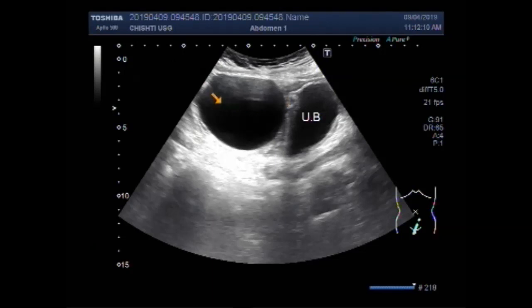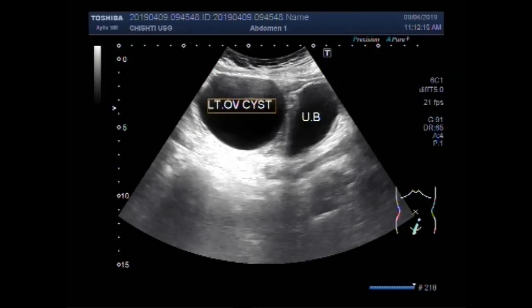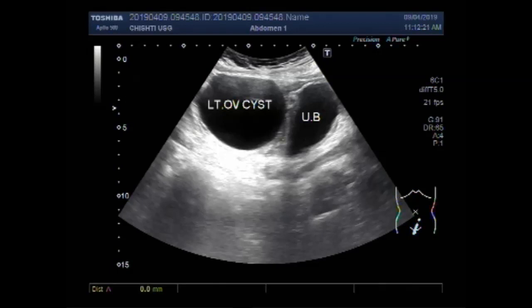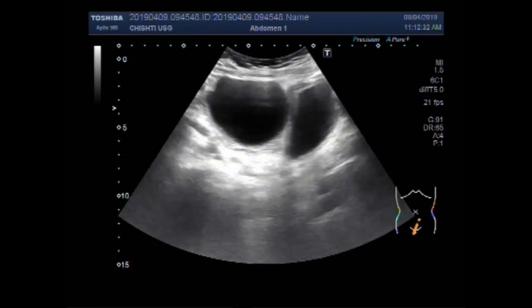Now you can see quite a large ovarian cyst. You can see the measurement of the cyst — it measures about 7.0 cm x 6.4 cm.